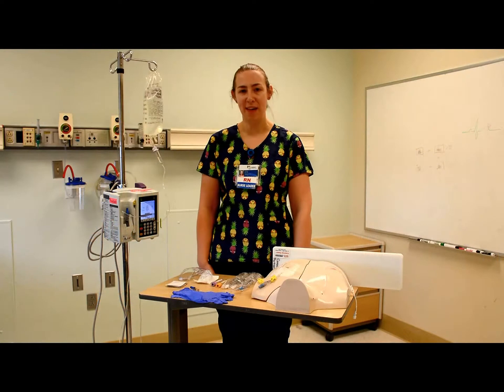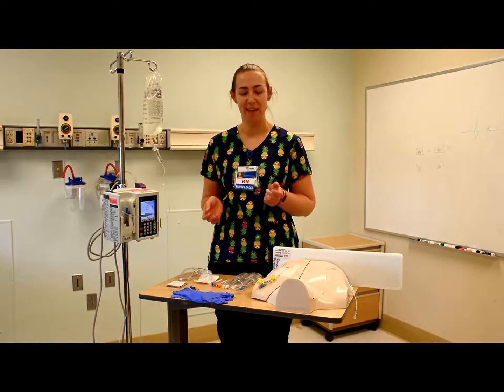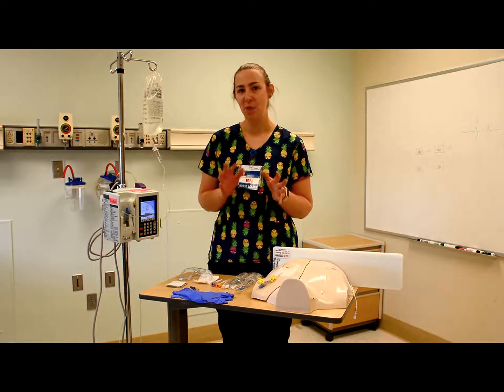Now I'm going to show you a method of lab draw called the push-pull method that eliminates the need to waste any blood.